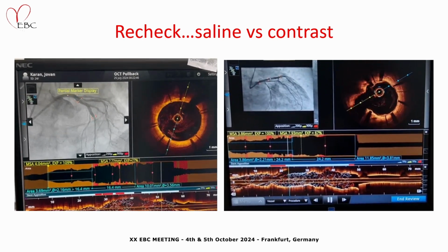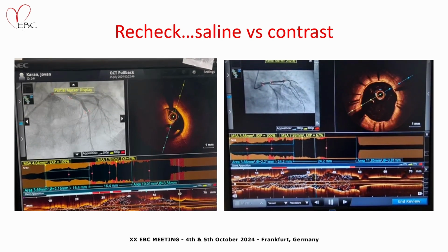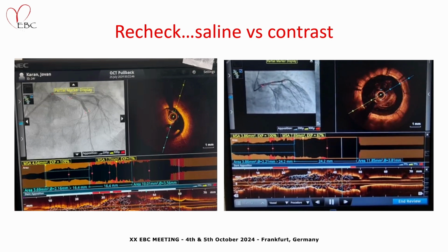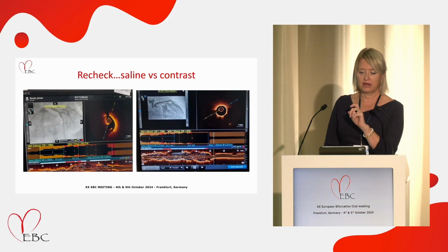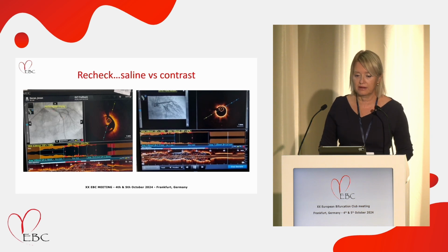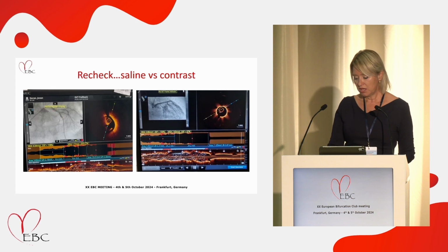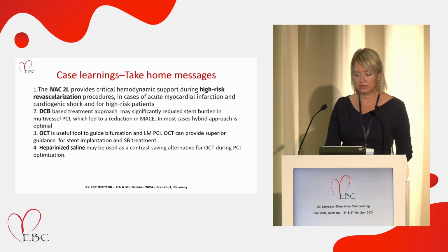But on both pictures, you can see that there is some problem with the stent expansion, and that was at the point of that highly calcified plaque in the proximal part of the LAD. So I treated with balloon, and I thought the result was good.